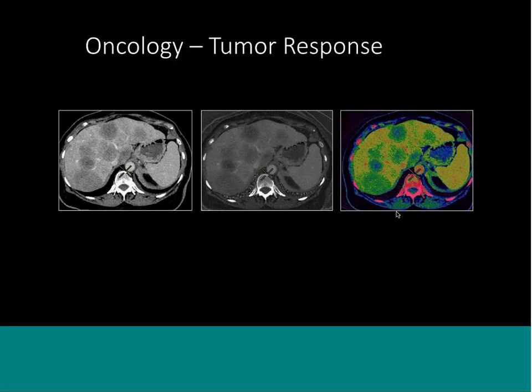The future of dual energy CT lies here. Right now, the way we measure whether or not patients respond to chemotherapy is making bidimensional measurements. This patient has a lot of liver mets from a neuroendocrine tumor. And in order to figure out whether or not these things on follow-up imaging have responded, we just take 2 or 3 of these and make measurements, okay, perpendicular to each other.